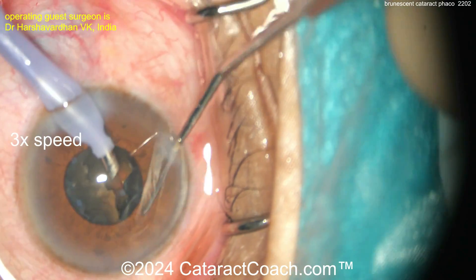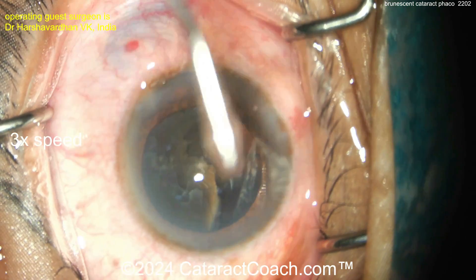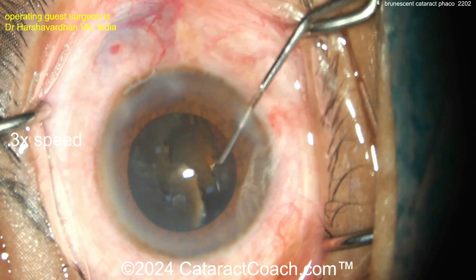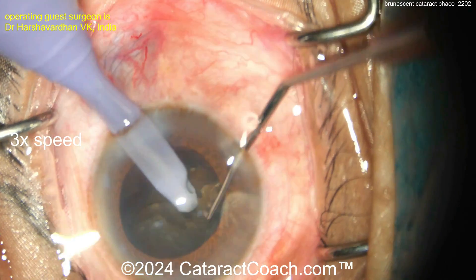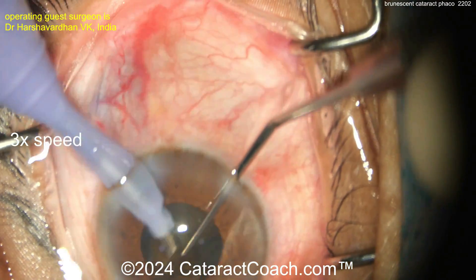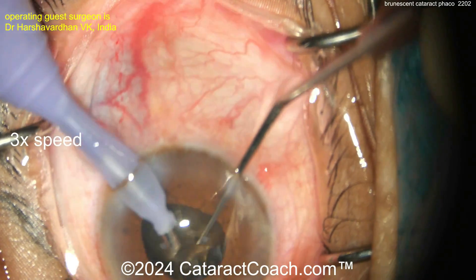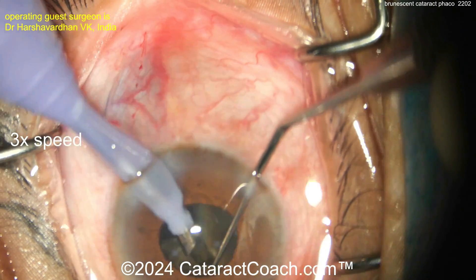The challenge here is that fiber-bound pieces are stuck together, making it very hard to fully separate them. Chop, chop, and more chop. More viscoelastic — great idea to re-coat that endothelium. The chopper goes around to rotate the piece; about half the nucleus has been removed. Another chop going in, taking your time.